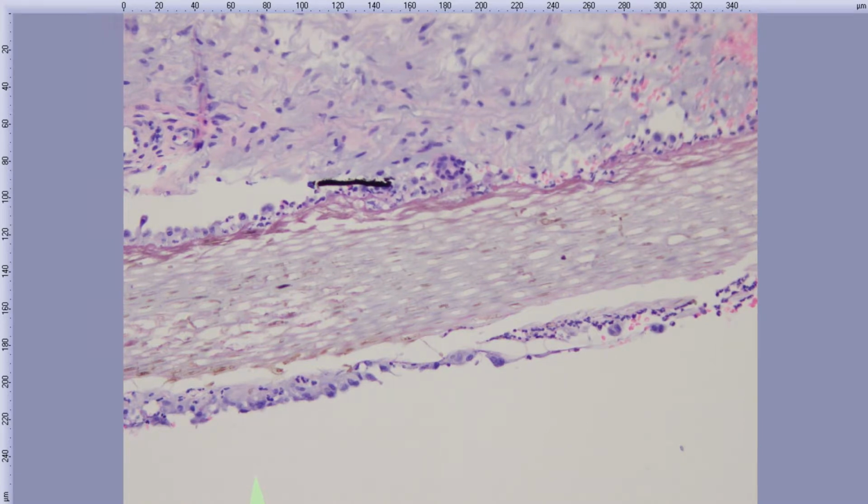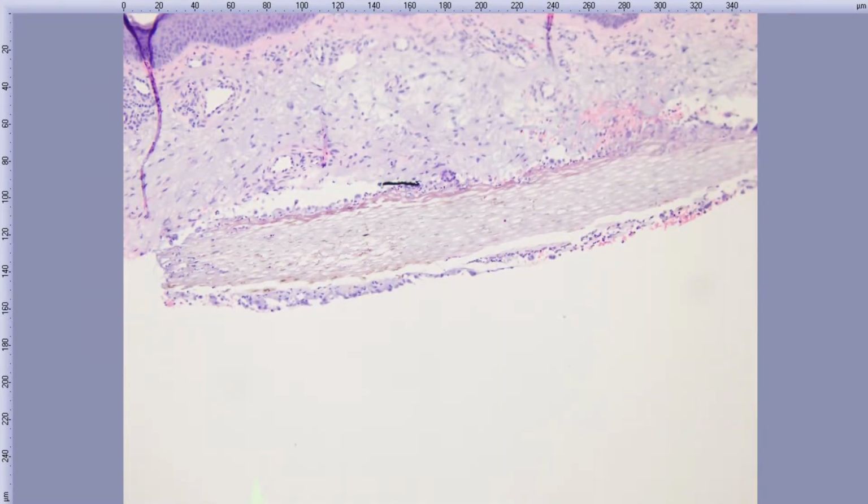And it's just a secondary thing that can come along with the wood splinter. I happened to actually see this patient myself, and I didn't treat her with any antifungal treatment or anything. I just saw her back in a few weeks, completely clinically resolved, so I didn't do anything else with it. So it's phaeohyphomycosis.